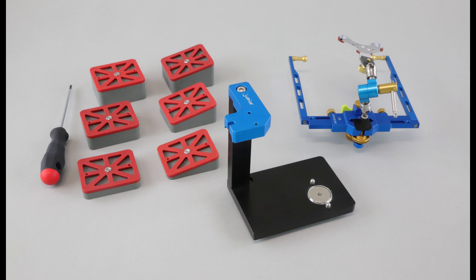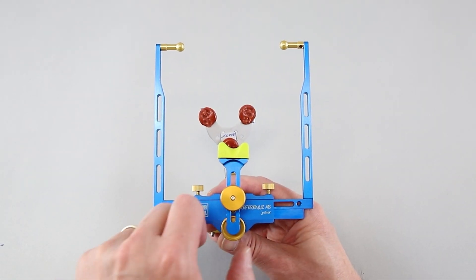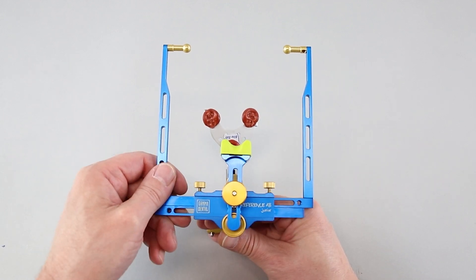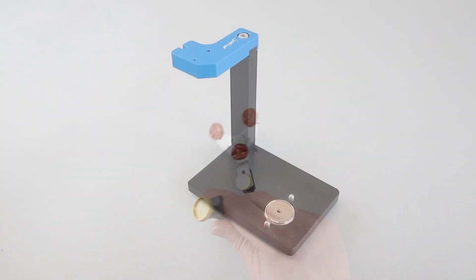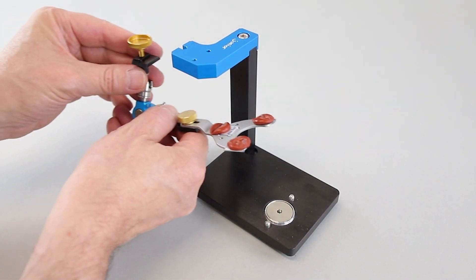The distance block plus mounting plate serve as transfer table. Remove the 3D joint support from the Reference AB Jr. face bow and mount it into the Transfer Stand AB Jr.